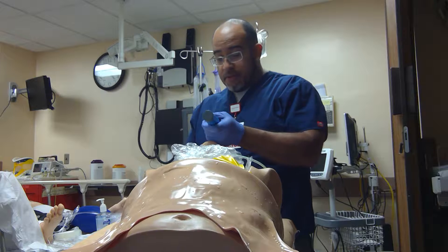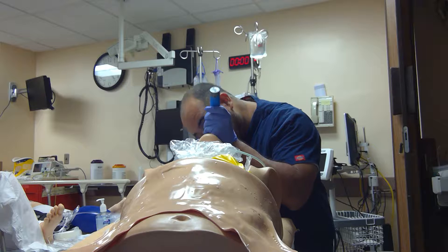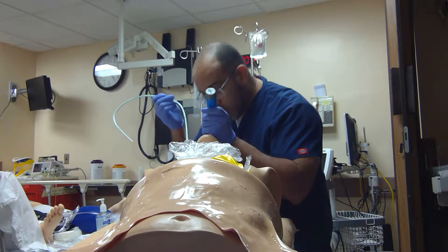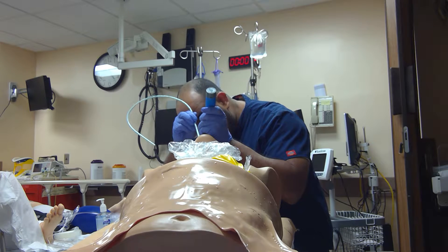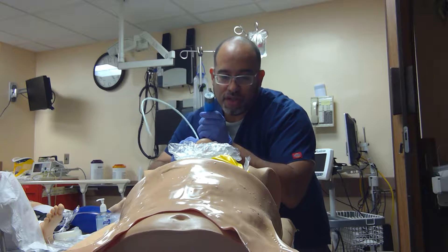Let's see what can happen now. The chords. Quarter turn left.